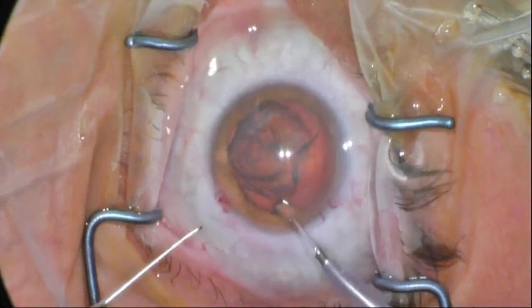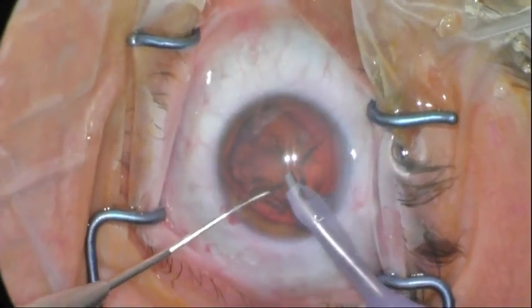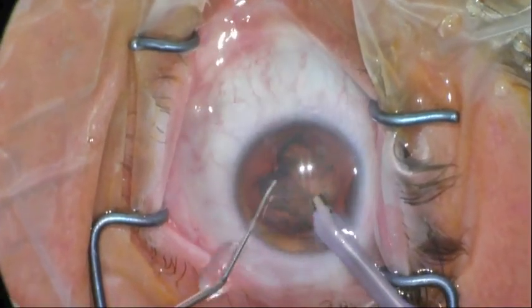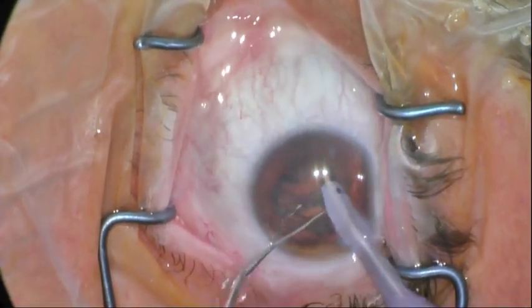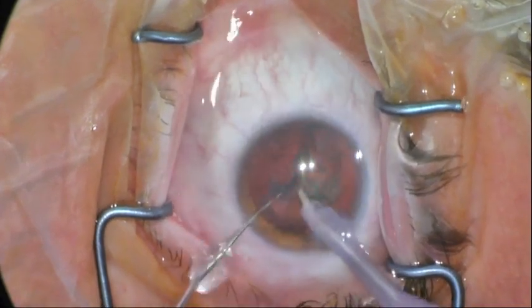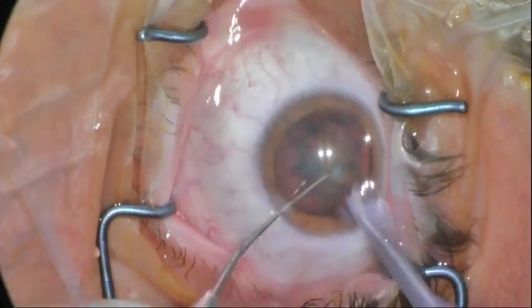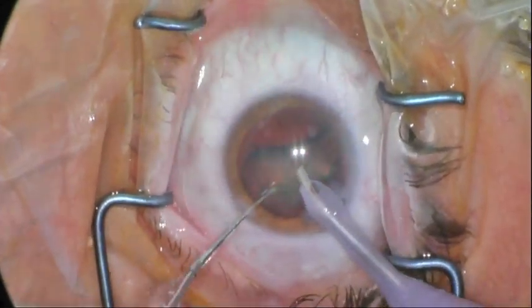And now we can aspirate the lens with the phacoemulsification machine just under vacuum, and no energy is needed for that. You sometimes have to use your second instrument to manipulate the lens to obtain proper occlusion. In order to make it safer, I'll release the lens here, rotate it, and then I can proceed with removal of the lens with vacuum only.